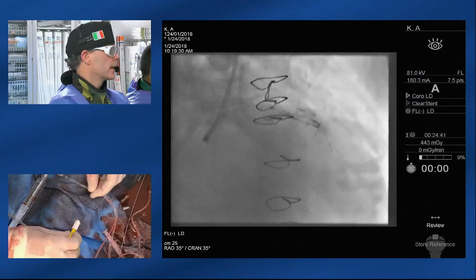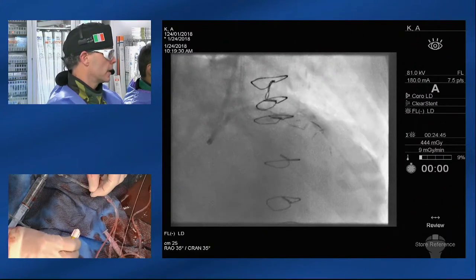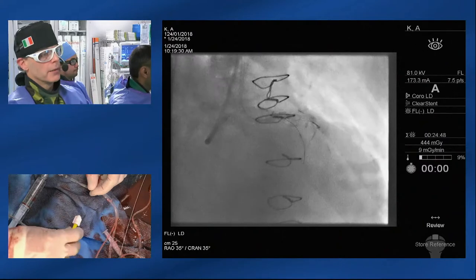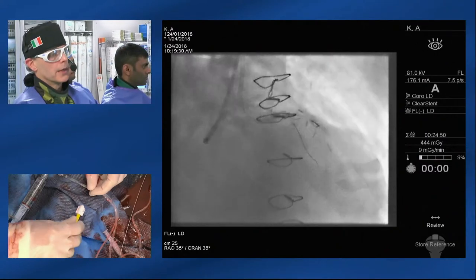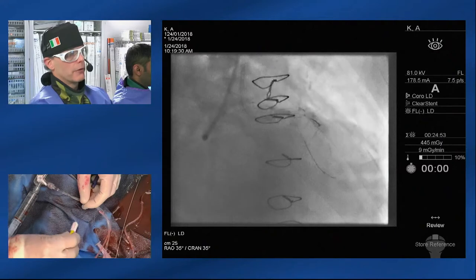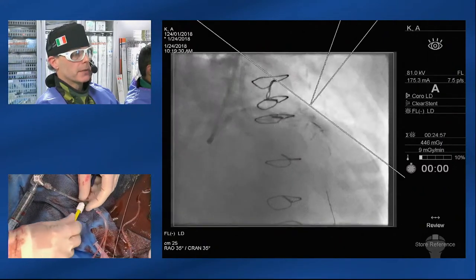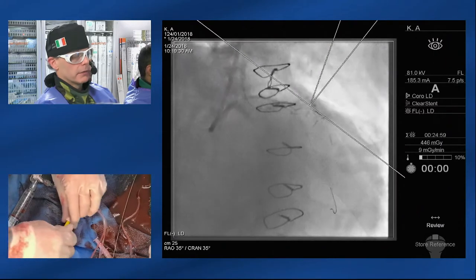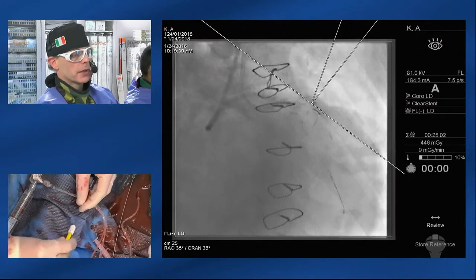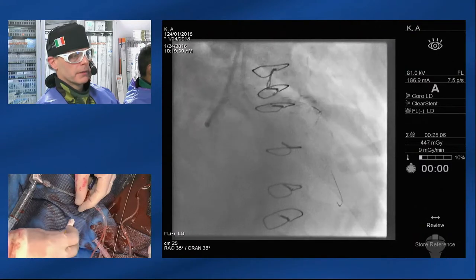When I come across people who don't use dual lumen catheters, most of the time it's down to a lack of familiarity with their use. You can see in this case they've been extremely helpful for the proximal cap. We're going to make sure Elliot's got a good road view. Just a little bit of contrast from the vein graft shows he's wiring the distal vessel — that's certainly one of the best moments when you wire the distal vessel via a dual lumen catheter after an externalized wire. Elliot definitely deserves a round of applause.